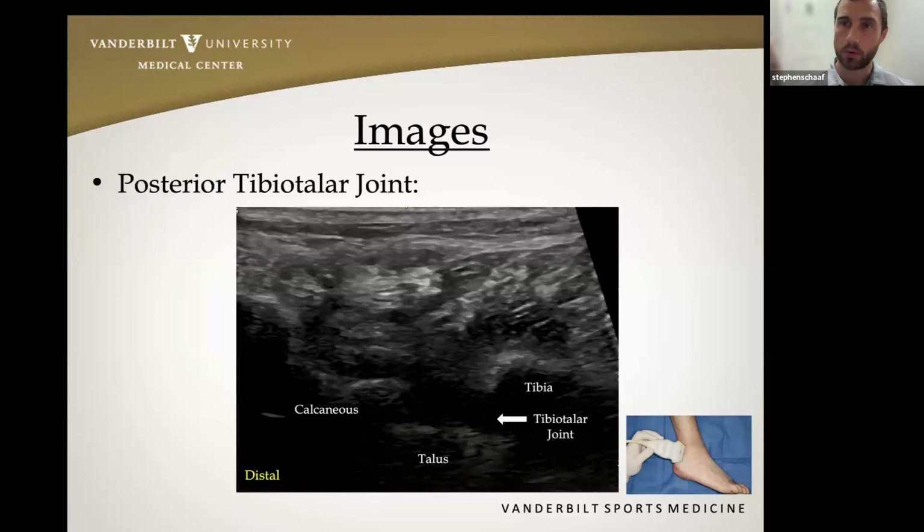I do think this takes a little bit of practice to get used to, just because as I'd mentioned, typically we're viewing these more anterior. So sometimes for this, you've got to be angled, but the main thing is just finding your home base along the calcaneus. And then sometimes, depending on the obliquity, you've got to angle it back at that tibia. Sometimes you do have to have some toggling as well, to ultimately optimize this image.